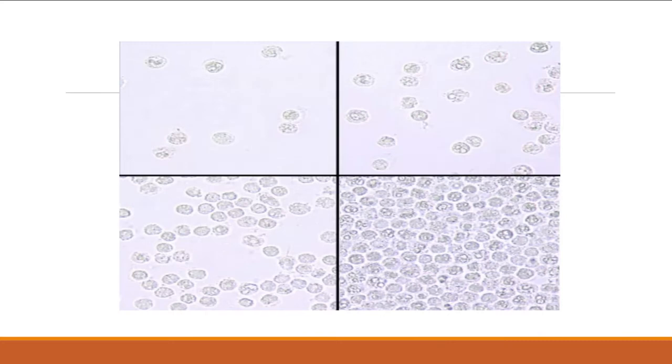This is another good picture of them. Oh, this one on the bottom is real clumped. So it's a really thick field of them, and that would be really positive on your chem strip too. This also looks like when you did a body fluid under the hemocytometer. So they look exactly the same. This is just what unstained cells look like.